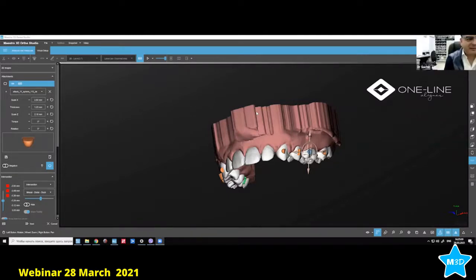One question is here: do you use negative attachment or power ridges? This is always the question. I talked about this with my friend Alexander here. When we do torque control on the upper, so many times we don't get good torque control.